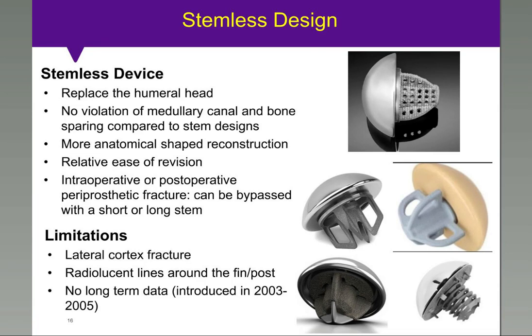There has been increasing interest in stemless design recently, with multiple design options available on the market for stemless reconstruction. The stemless design relies on fixation in the metaphysis at the head-neck junction of the proximal humerus. They replace the humeral head without violating the medullary canal and are more bone-sparing than stem components. They allow easy reconstruction of the proximal humerus with relative ease of revision. Intraoperative or postoperative fractures can be bypassed with a short or a standard stem component.